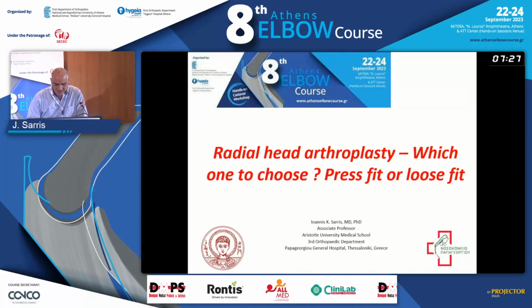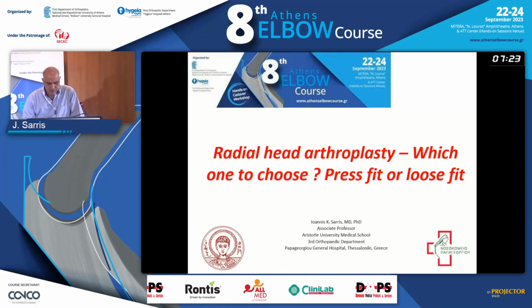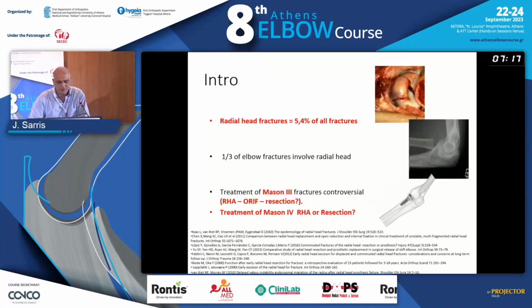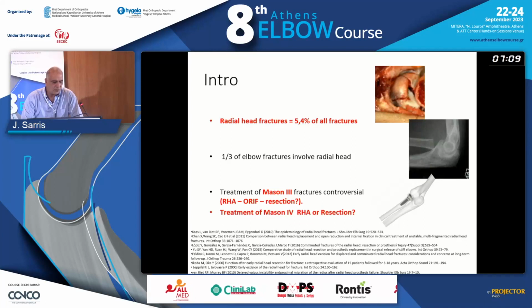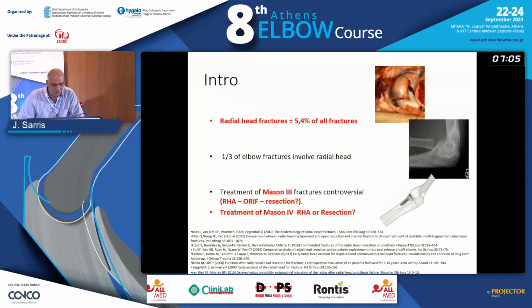So I will talk about radial head arthroplasty, which one to choose, press fit or loose fit. Radial head fractures account for 5.4% of all fractures. It is involved in 1/3 of fractures of the elbow and trauma of the elbow. Now, treatment, and that I just put it there to connect with the other speakers.